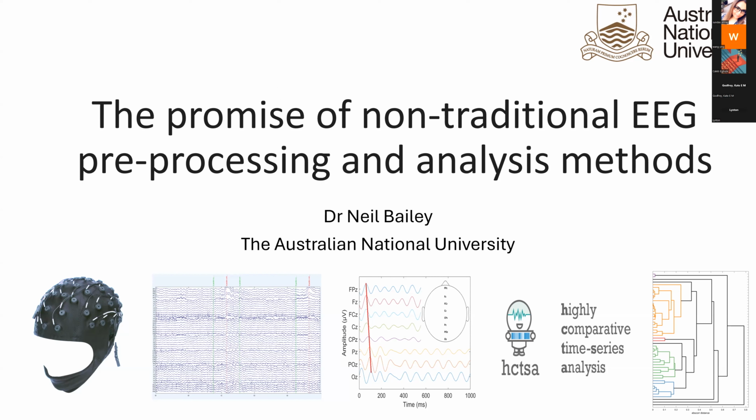But our results showed the same pattern where a 0.5 high pass filter actually performed better at detecting effect sizes of interest. And I'm wondering if that's because even though it does reduce the amplitude of the slow latency ERPs, the 0.5 high pass filter also reduces the drift and that sort of thing that can be in the signal and contribute more noise, and so actually disrupt our ability to detect the effect size.